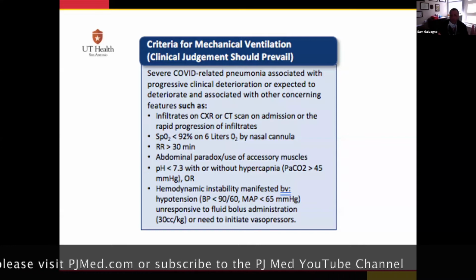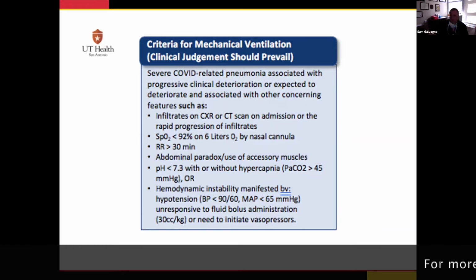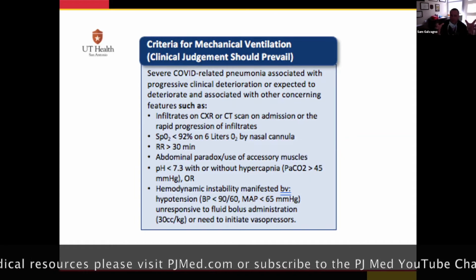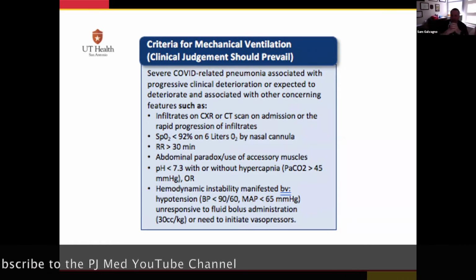So I would say the important point here is you can look at these numbers, and if the patient looks pretty good, okay, maybe we prone them, self-proning. That's what's really big right now. Since the last time we talked, it's even more endorsed. And you're going to see that when you guys get deployed to these centers. So what I'm saying is that clinical judgment box really does mean that. It means your judgment, but it also means integrating your exam findings, your interviewing, and your monitoring of the patient. What else, sir? Thanks.